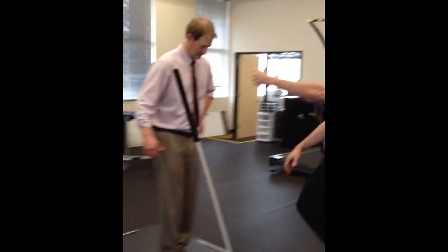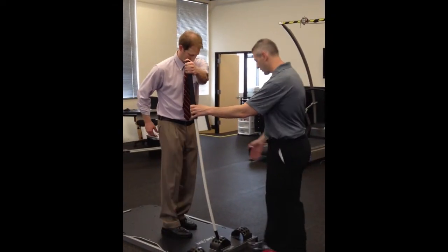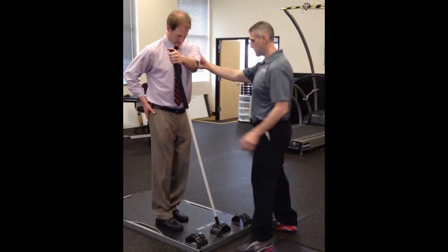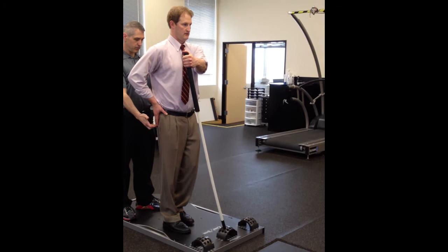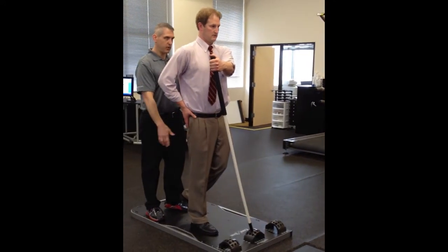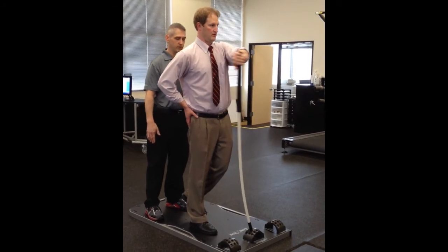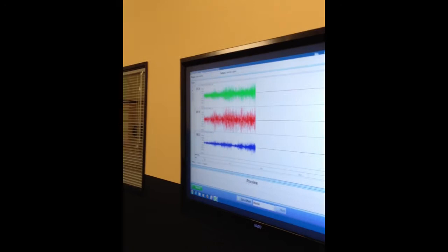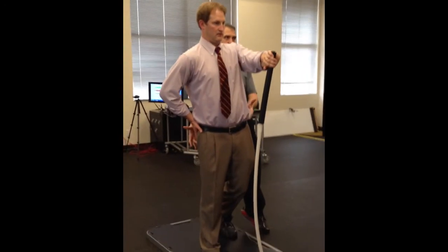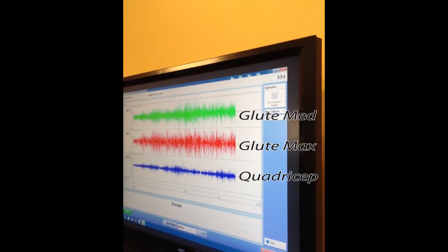Standing up here on that one leg, you're going to be going across the body. I find across the body is a nice way. Come up this way a little bit more — that's it. Let's make it a little more challenging if possible. Get tall through that hip, right there, good. Push down with that foot, and now bring that across the body. Hold that, hold that. Don't swing out — stay tall, that's better. Stay tall, that's it, you got it, right there.